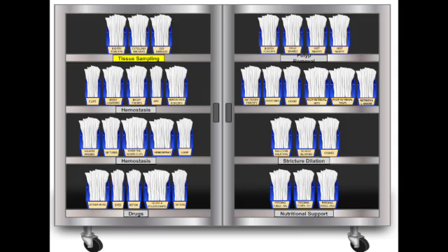Good phrase. Then, the standard clips, through-the-scope clips, or TTS clips. These seem ubiquitous. They are. And for technicians, you basically need these ready for almost any procedure because they do so much. Three main functions. Okay, first. Hemostasis. Obvious one. Clipping bleeding ulcers, Mallory-Weiss tears, Dieulafoy lesions, diverticular bleeds, post-polypectomy bleeding sites, just closing the vessel mechanically.